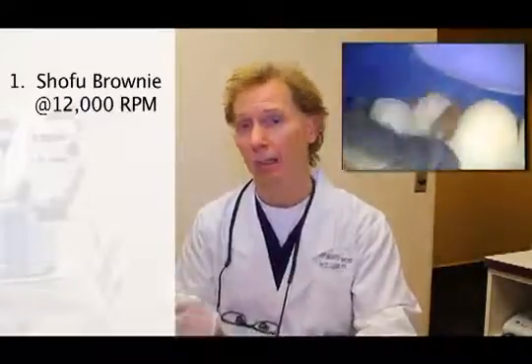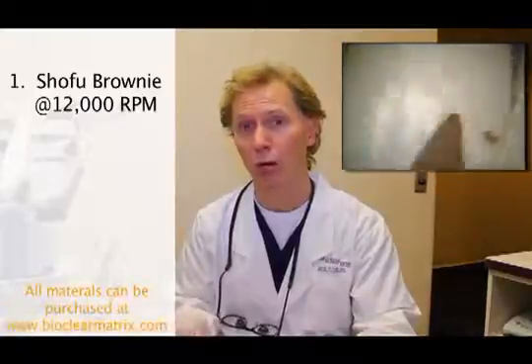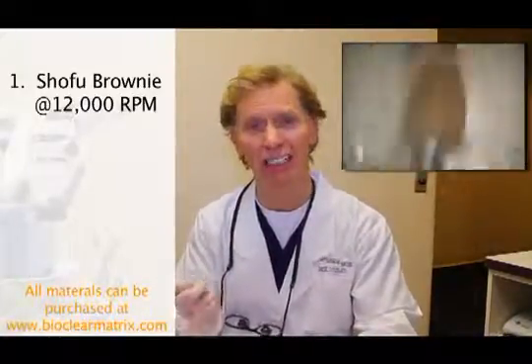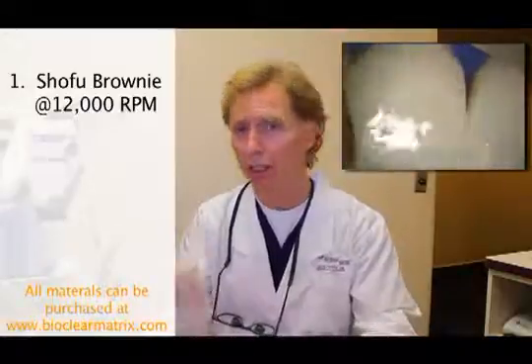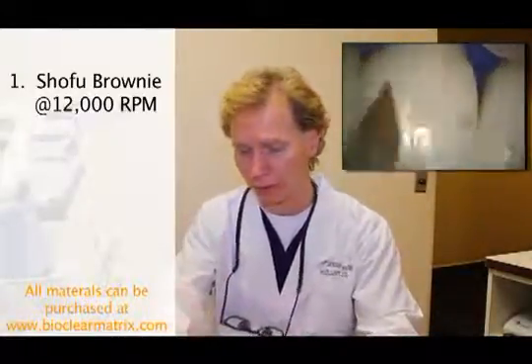All right, so let's review. Step number 1 of polishing is the brownie. We want to use the brownie at about 12,000 RPMs, about medium speed and a high speed with water. We want to marginate with the brownie because the brownie does not cut enamel. It's a beautiful way to get the infinity edge without cutting the margin open and getting that stupid white line. So the brownie is step number 1. We create little grooves, mamelon grooves with the brownie.